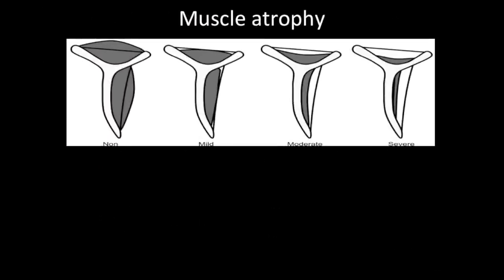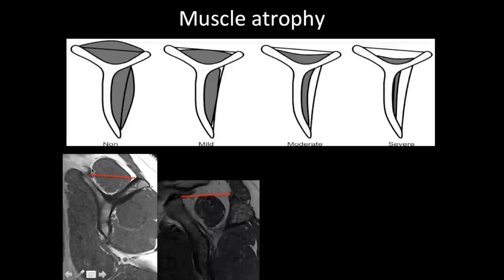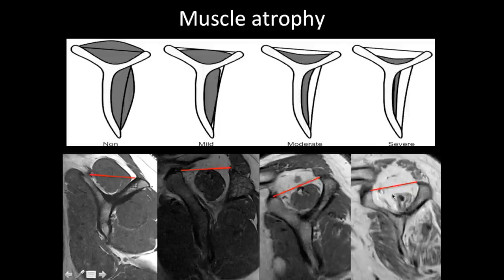Muscle atrophy is assessed using a reference line joining the coracoid process to the spine of the scapula for supraspinatus, and the spine of the scapula to the inferior tip of the scapula for infraspinatus. In a normal muscle the muscle bulk extends above the line; mild atrophy — the muscle extends to the line; moderate atrophy — the upper margin of the muscle is below the line; severe atrophy — the muscle is situated in a corner of the supraspinatus fossa.